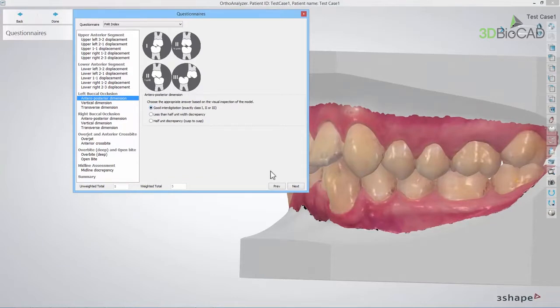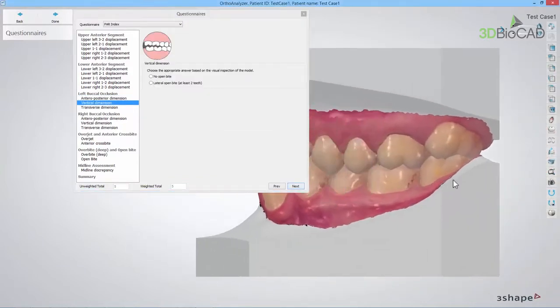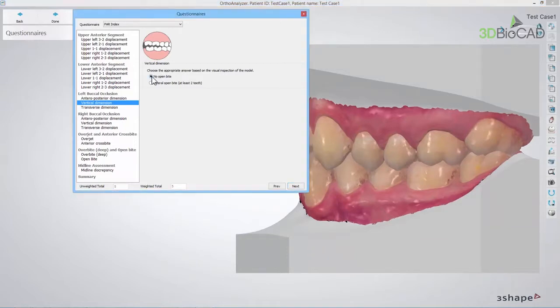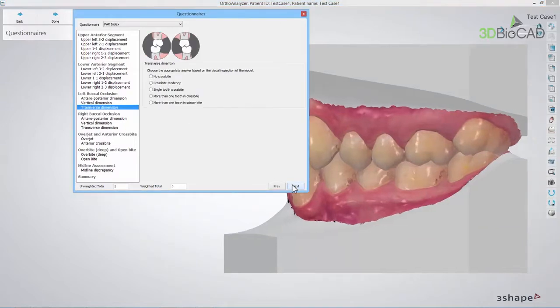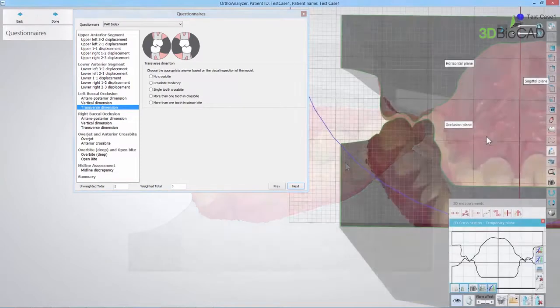Next is the Vertical Dimension. Here you should look for an open bite, inspect the model and choose the appropriate answer. The final step is the Transverse Dimension, where you should look for crossbite. Inspect the model and choose the appropriate answer.